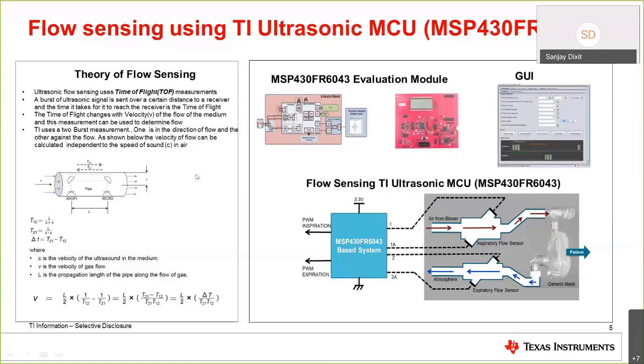So we have an EVM which has the microcontroller on it. To this EVM, you must attach two ultrasonic sensors. And then you have a GUI which gives you all the information of the flow waveform and so on, on the computer screen.